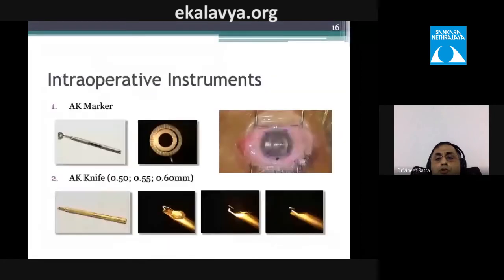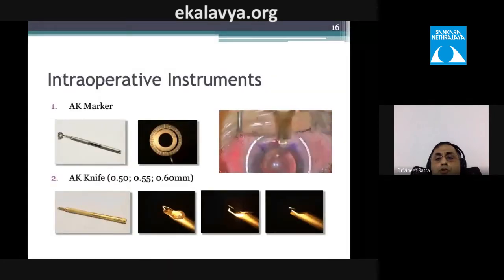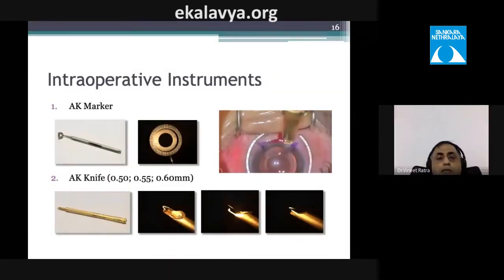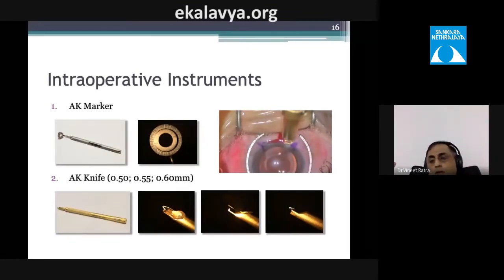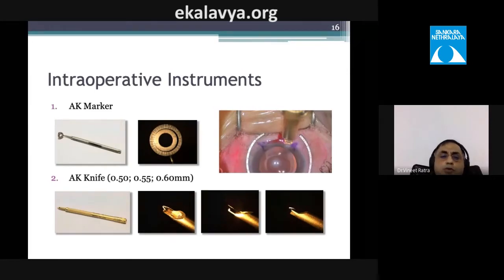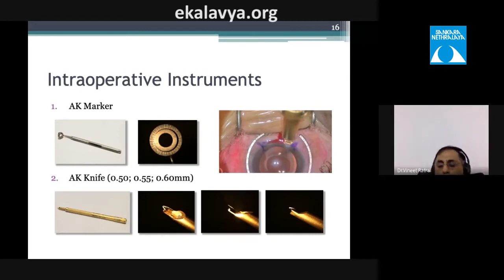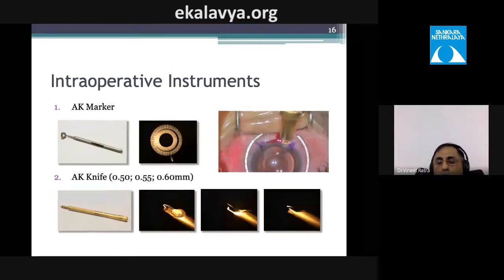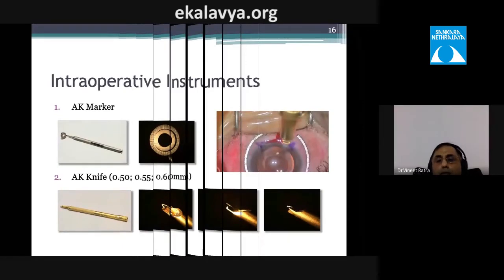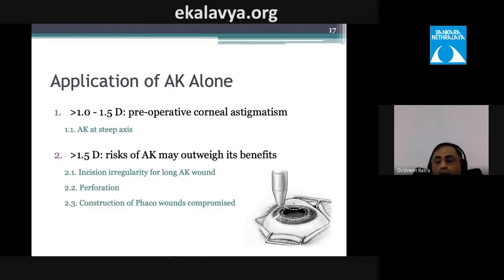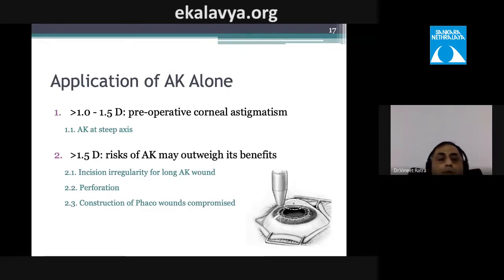To perform a limbal relaxing incision, mark the axis, then hold your blade perpendicular and set the gauge to approximately 0.55 or 0.6 mm depending on corneal thickness, and run an incision parallel to the limbus. An LRI or astigmatic keratotomy is suitable for greater than 1.0 to 1.5 diopters of astigmatism.